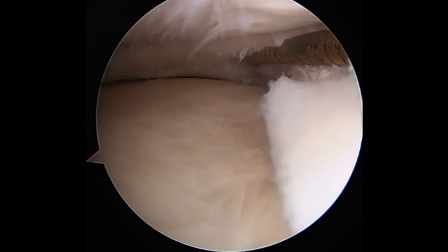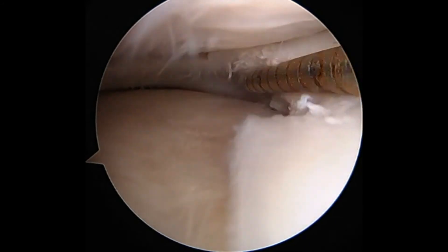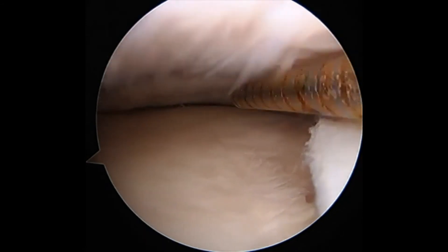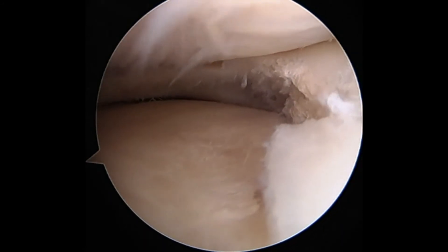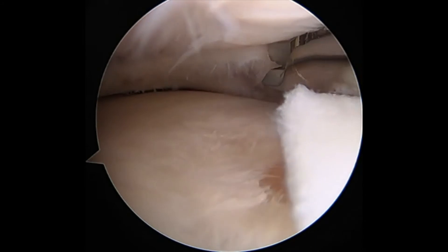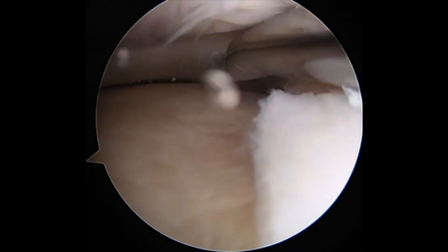The following is arthroscopic footage from a real patient. Arthroscopic meniscectomy is a procedure that is performed through two small incisions. Through one incision, I place a camera, and through the other incision, I place my instruments. This is a patient with a medial meniscus tear of a right knee. First, I was using a probe in order to probe the tear and to characterize the findings.